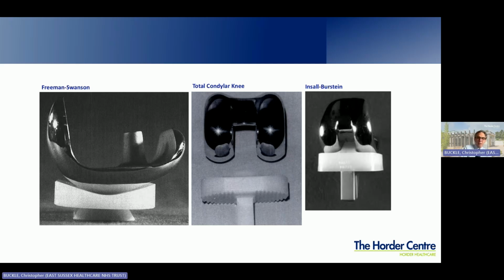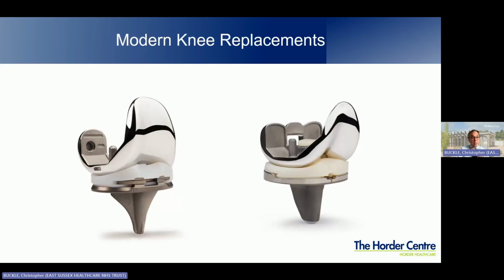And when we look at today's knee replacements, they are actually very similar in their design. So these are two knee replacements we use here at the Horder Centre. The one on the left is something called a Vanguard knee replacement, which has been in manufacture for about 18 to 20 years now. And the one on the right is the later generation of this knee replacement, and that's been used for approximately 10 years now.